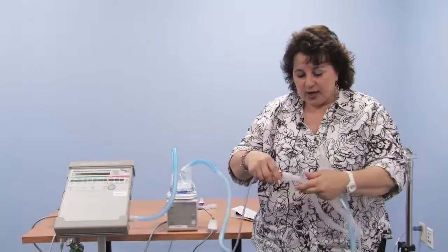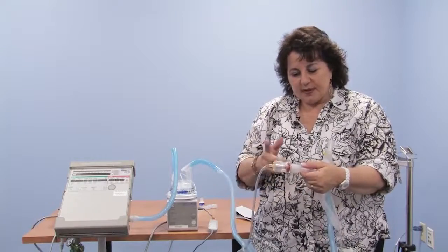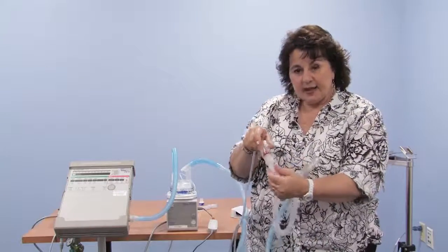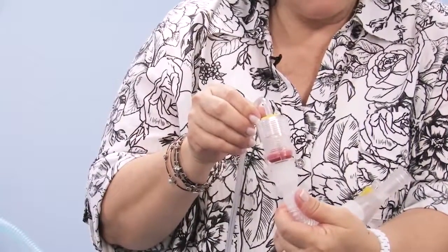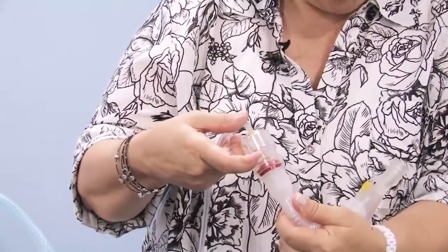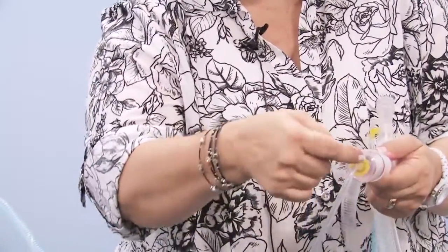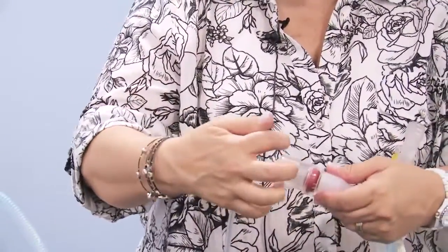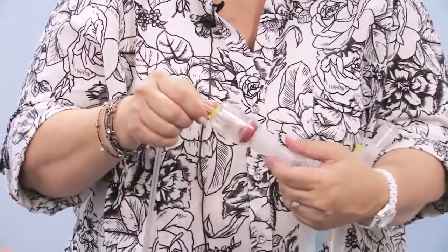The exhale valve is where the child blows out. A lot of these pieces come apart so you can drain water and do things. What's different about this piece here and the one for the 1150 is that this exhalation valve actually is where you control the setting for the PEEP, or the positive end expiratory pressure. There are numbers here that go from 0 to 20 centimeters of water. It's a spring-loaded valve, and we will push on the yellow. It says push to turn, so push on the yellow and turn this to set the PEEP where we want it, between 0 and 20. Most children would use 4, 5, or 6 of PEEP, or positive expiratory pressure.